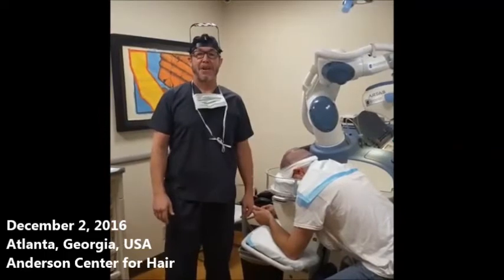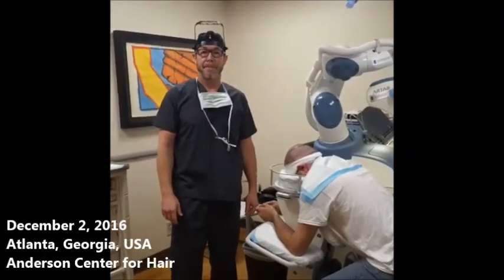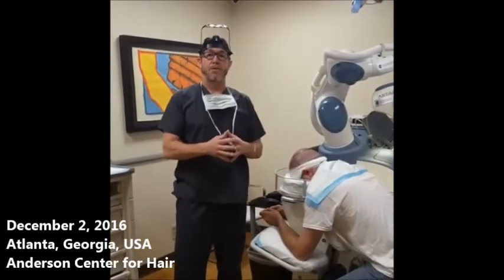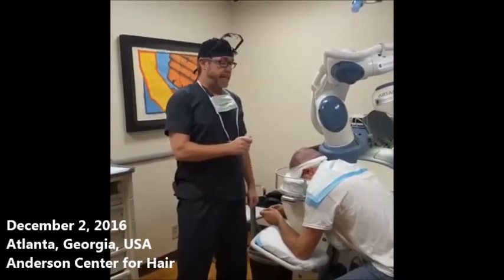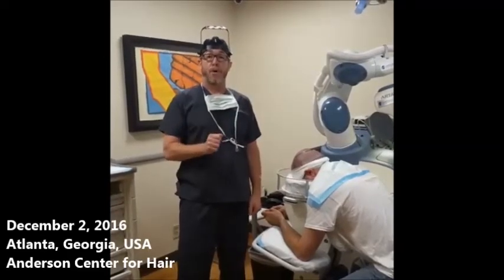Good morning. My name is Dr. Ken Anderson. We're here at the Anderson Center for Hair with today's patient, James. This is part of an ongoing series of techniques in ARTAS robotic hair transplant surgery, and today I'm specifically going to talk about the length of the hair that is optimal for the robotic procedure.